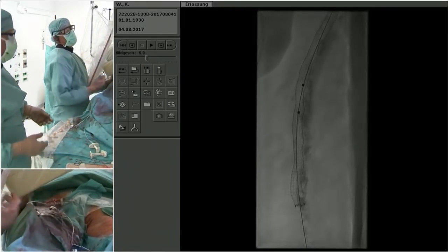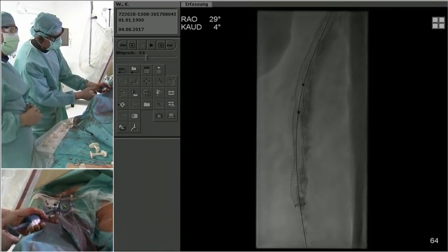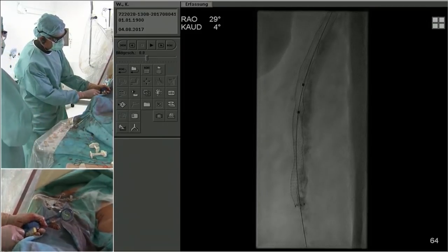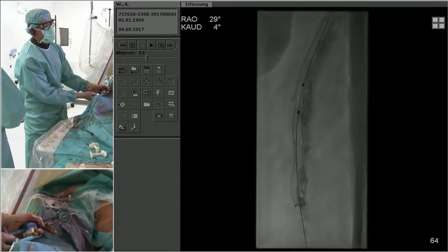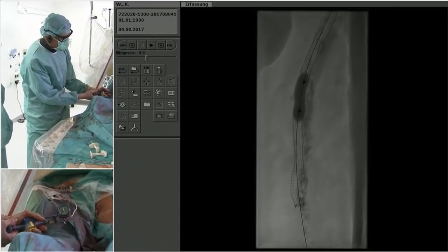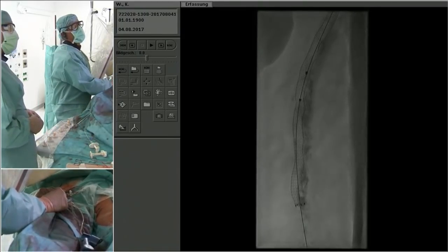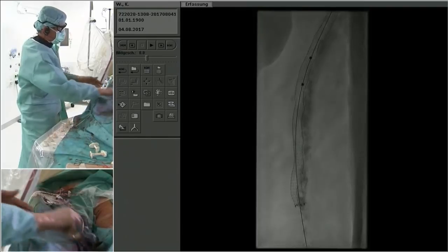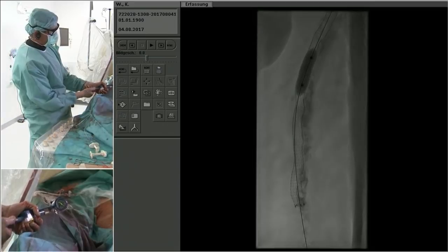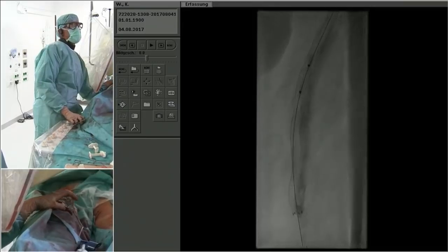Andrej, what is the size of this balloon you're using? Yeah, 7/20, so I balloon it up now to 24 atmospheres, which, the balloon may have ruptured already at the plug without the Viabahn. And it still shows recoil here, the artery. Yeah, so what next? I mean, you could take, and we have done it, for example, a 5 and 8 millimeter 8/20 balloon. Haven't seen destruction of the Viabahn. You could take, of course, a high pressure Conquest 7/20, which will not open to 7.5. That's great.